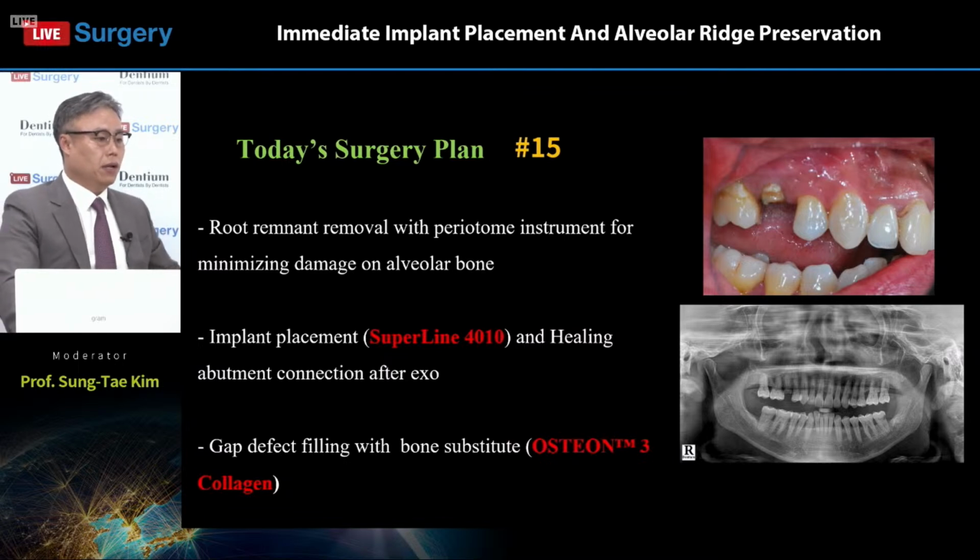The gap defect will be filled with a bone substitute, probably the synthetic bone substitute Osteon 3 Collagen, a collagenated bone graft material.